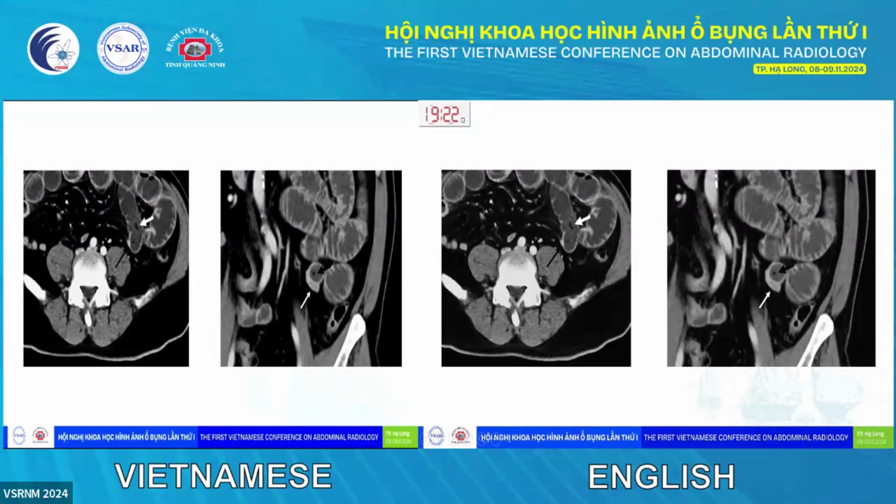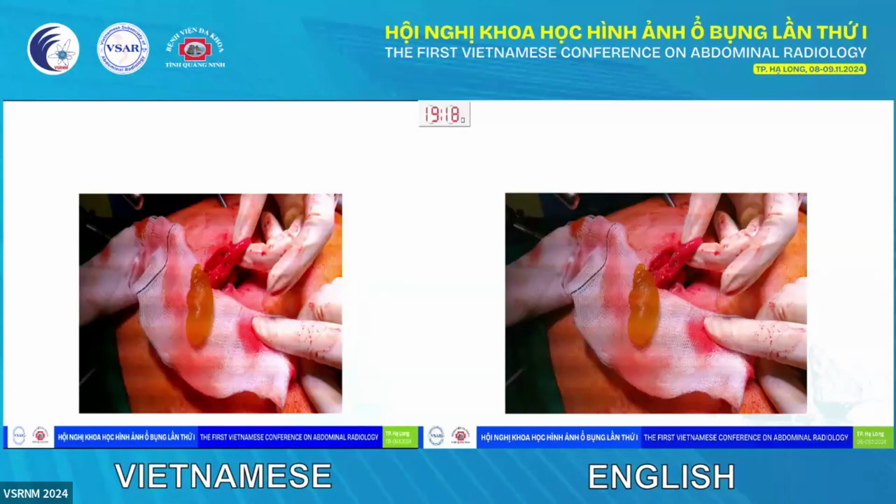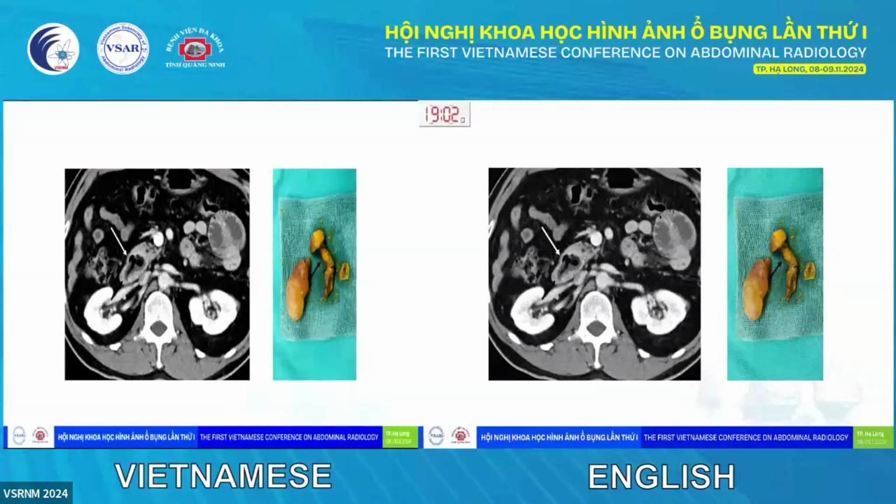However, as the patient's symptoms continued to worsen, this patient was taken to surgery. On surgery, the surgeons found a rather interesting lesion within the lumen of the small bowel, and it was postulated that this could be an attap chee seed, which is actually a type of dessert that is quite popular in Singapore. At the same time, the surgeons also did an endoscopy and showed that there was a mushroom bezoar located within the duodenum, and this was eventually fished out and looks like a shiitake mushroom.